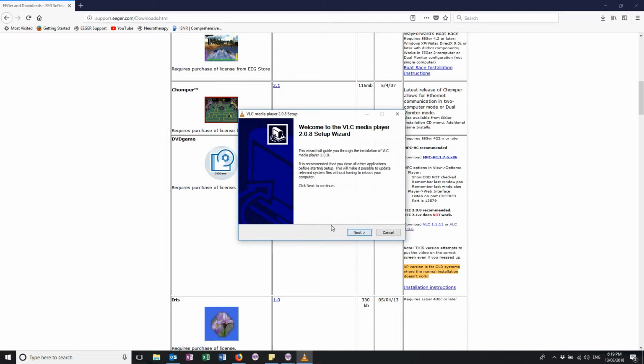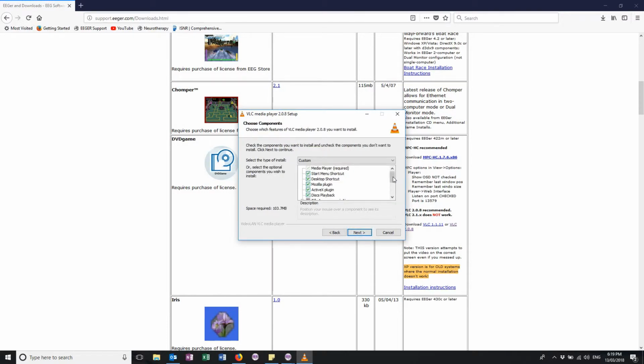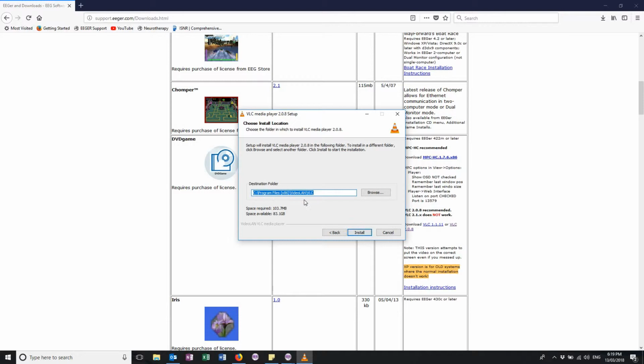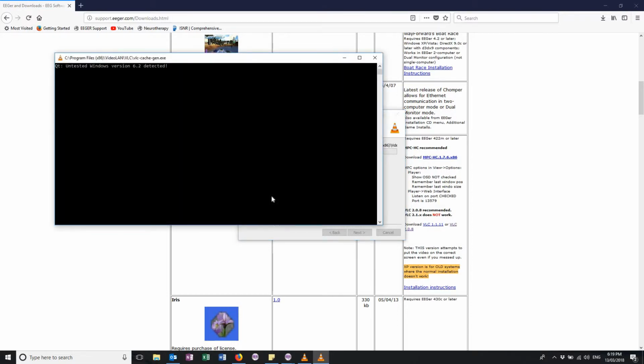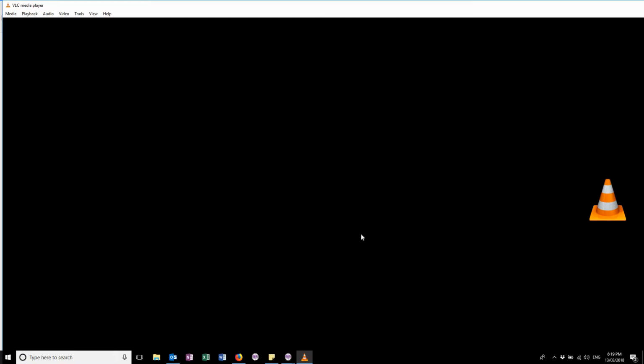So we finished uninstalling, and now we go to the install wizard. So you will obviously agree to this, and generally it's fine to just leave all of these ticked. So you do that, and that's a fine location to load it in. So you install. And it goes through this process. And then you want to run, so you click Finish. And there you go, it's opened up.